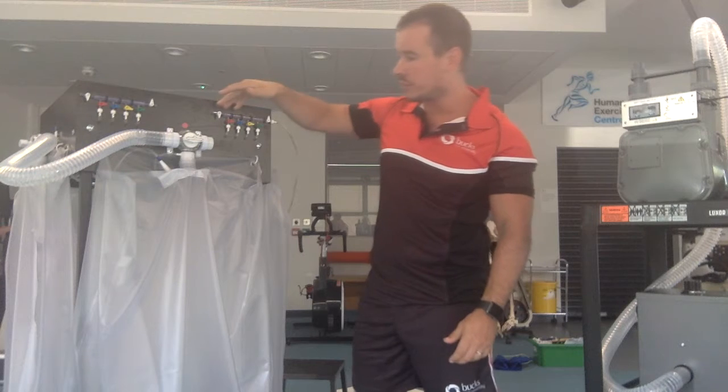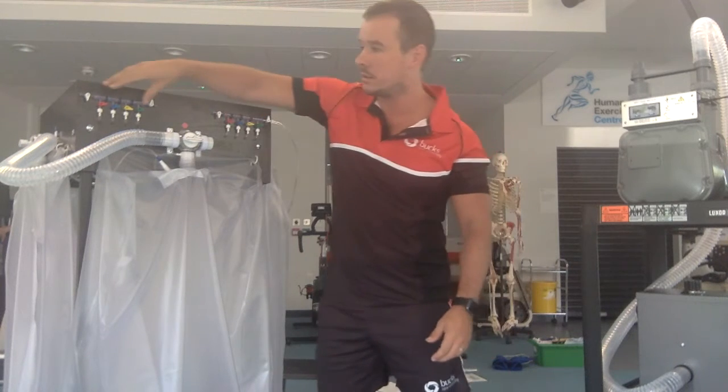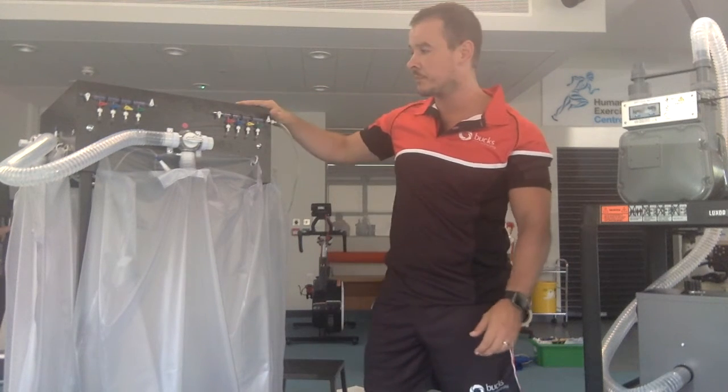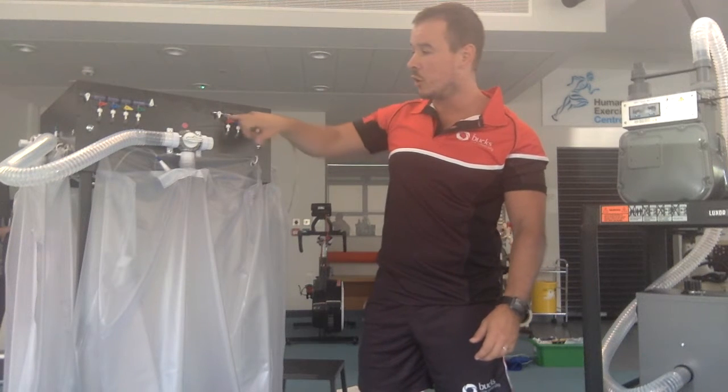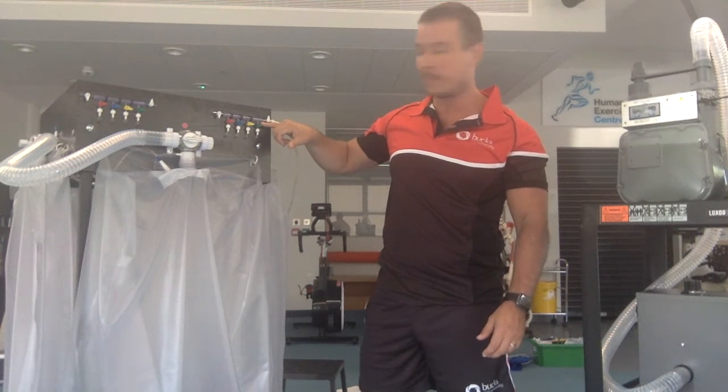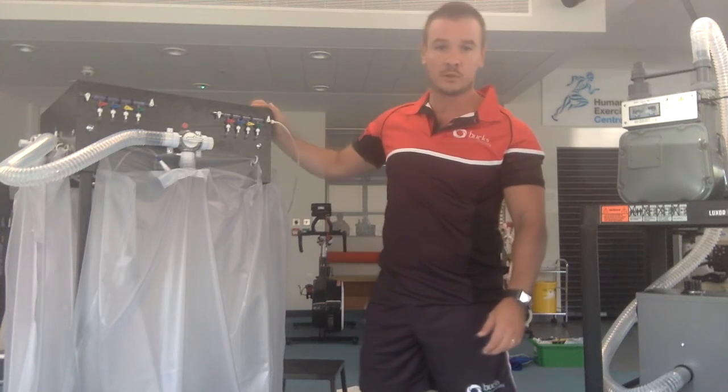You'll notice at the front these small taps on either side. The red, blue, yellow and green taps should all be horizontal and the white taps should be vertical.